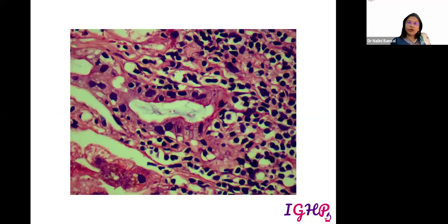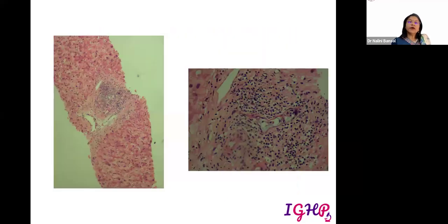Now, again, for this point, we need to have very good sections to identify these cytoplasmic vacuolization and these changes of the nuclei, because if the sections are not very good and you're not looking at them carefully, you can also see these changes in a normal bile duct. So you need to be very sure that these are actually ductulitis changes happening because of the rejection infiltrate, or whether these are because of abnormal sectioning, or are just artifacts occurring in the liver.